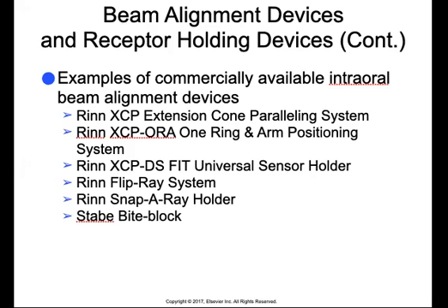You see that one actually looks like the exact same picture there. In the class, you'll notice we have one of them where the anterior holder is at an angle, and the other one where it's flat. The one that's at an angle is the one we'll use for a paralleling technique, and the one that has a flat holder is something that we'll use for a bisecting technique.